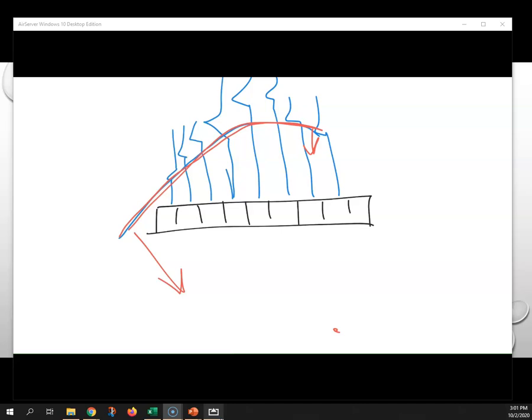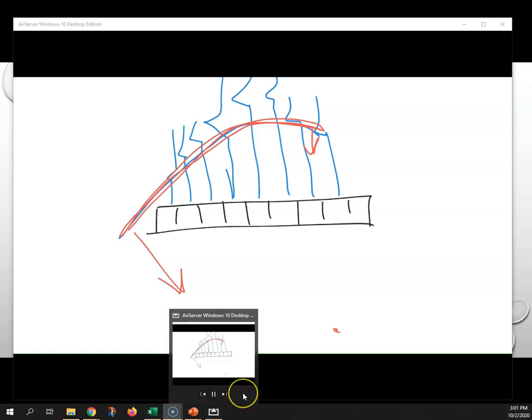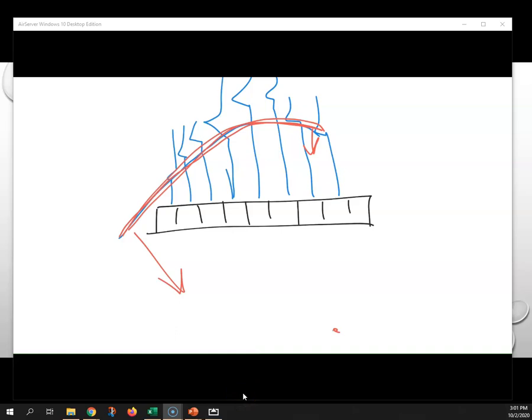Okay, and so I'm not going to draw the wavelets on this because the firing pattern tells you exactly what the shape of the wavelets are going to be. And this is a standardized technique, these firing patterns, across ultrasound, so that if you see this on the SPI exam, you will recognize it. So that's focusing and steering.